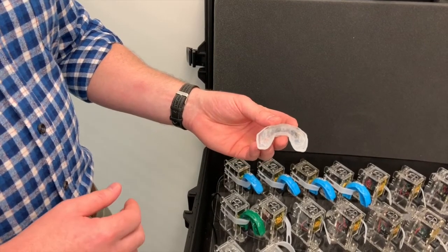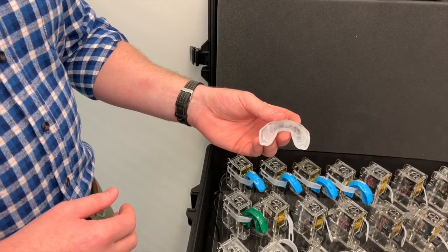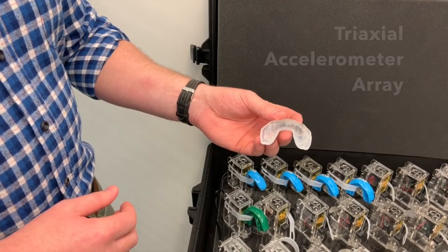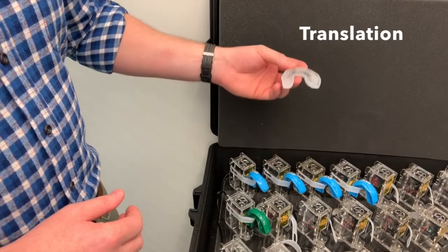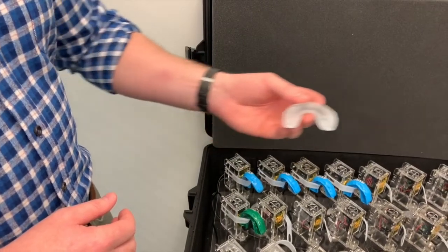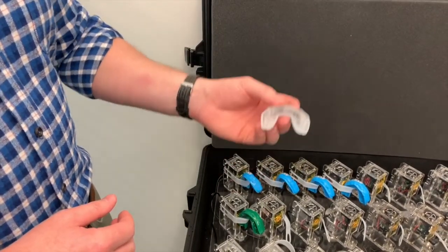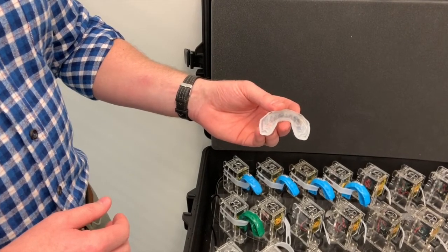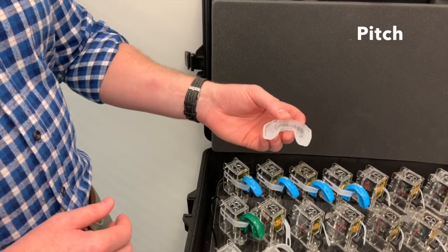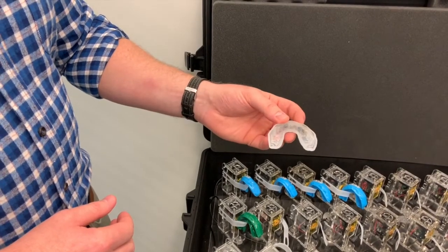These instrumented mouthguards have sensors that measure the movement of an athlete's head during sports. They have a tri-axial accelerometer which measures translation — that's forward and back, left and right, and up and down. It also has a gyroscope which measures rotation, so that's pitch, roll, and yaw.